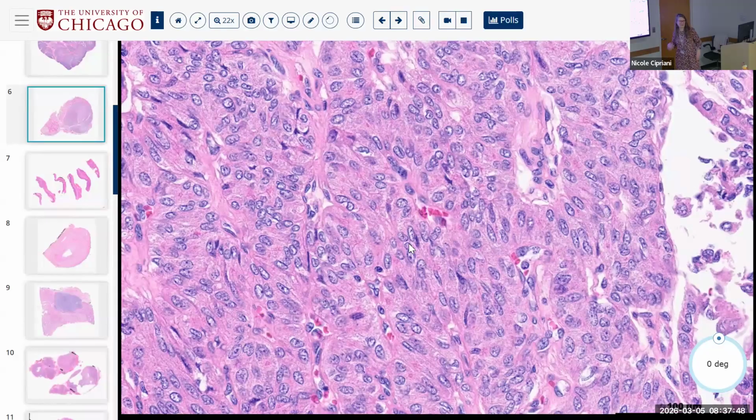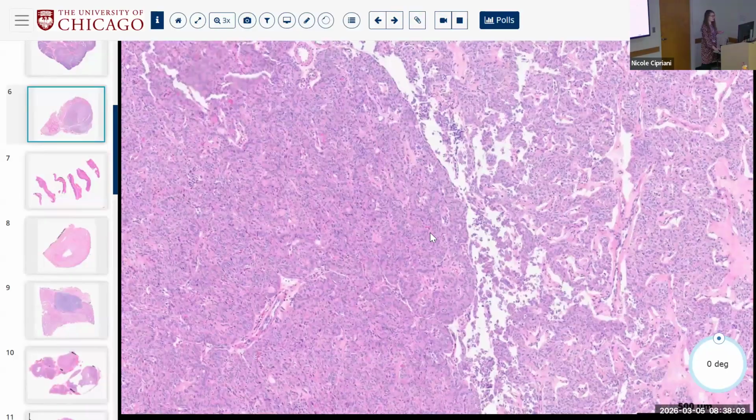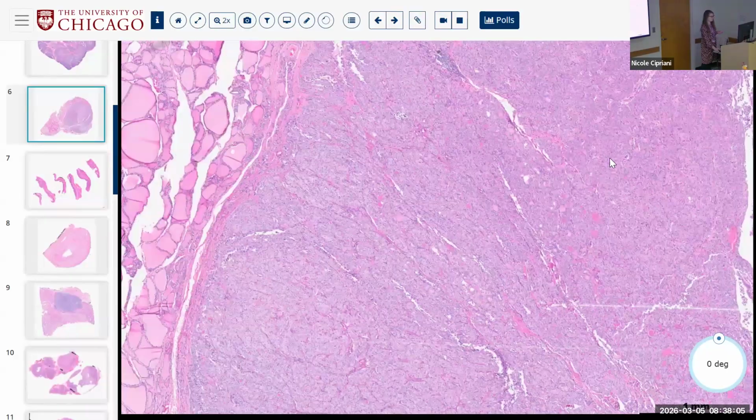The word trabecular from the thing. Hyalinizing trabecular tumor. Right, you could think about hyalinizing trabecular tumor because of the trabeculae and the circumscription, right? So those are common features. However, what about this tumor does not match hyalinizing trabecular? What does it lack?